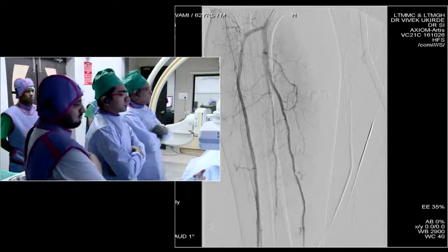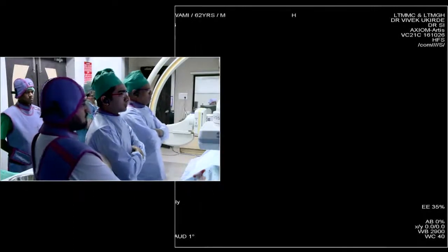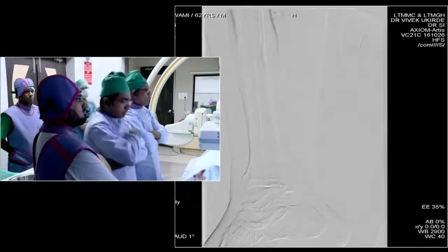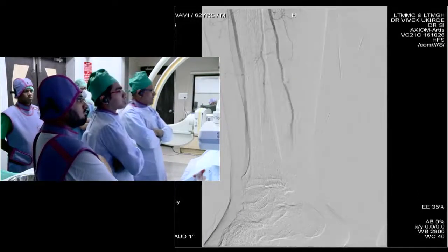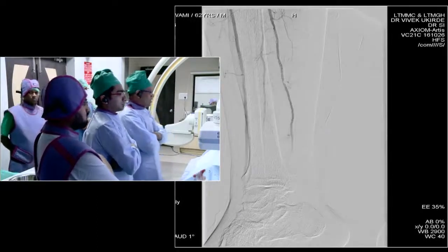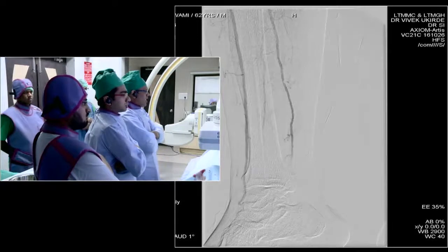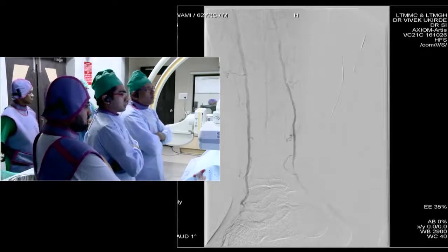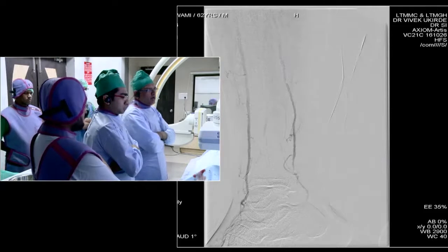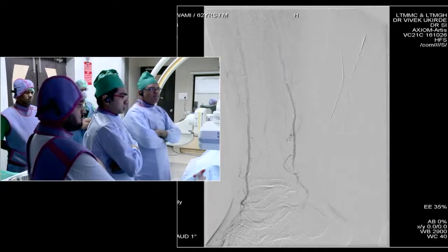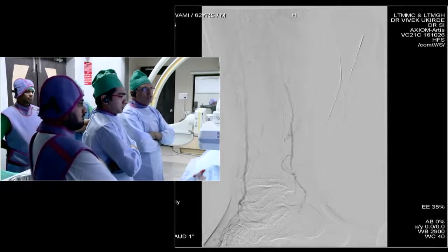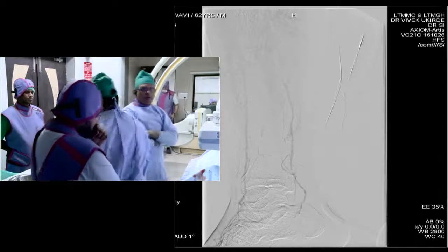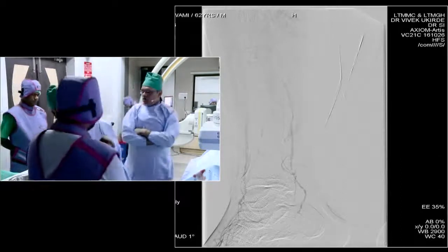In the next run, we have gone from the opposite side with a six French crossover sheath and crossed the lesion with a 0.014 Command wire. So now we are all set for the angioplasty. I'll be using a 2 mm balloon, 2 mm by 250.